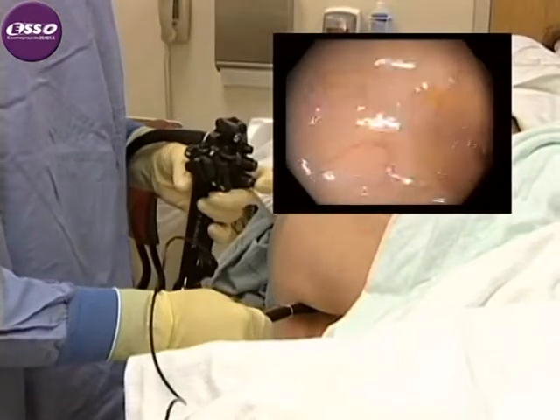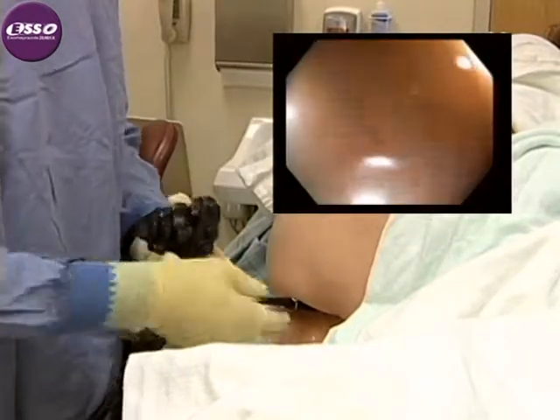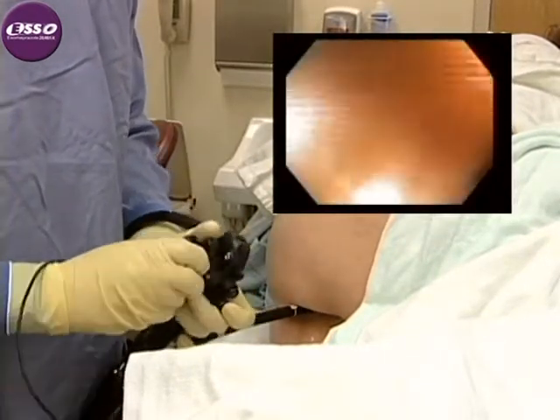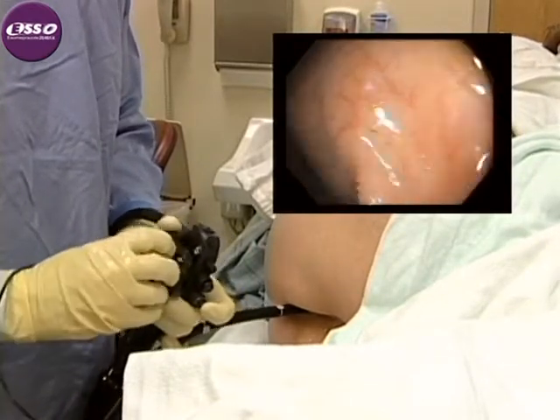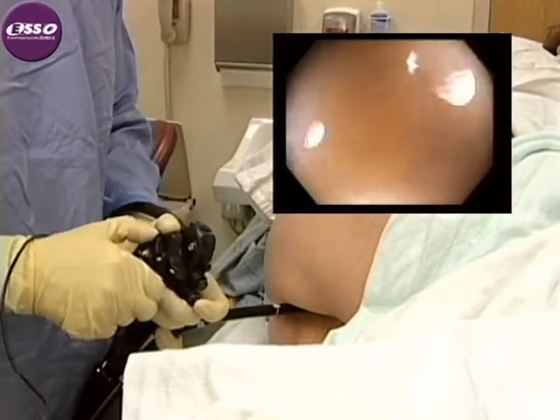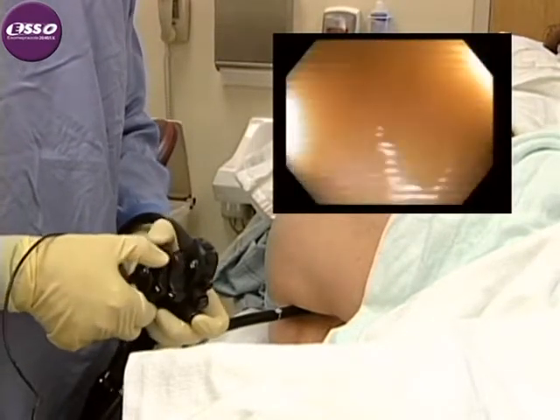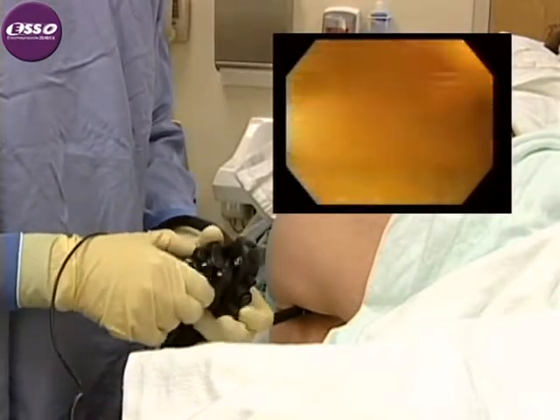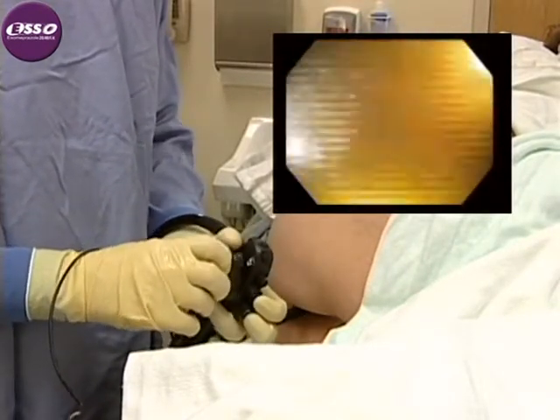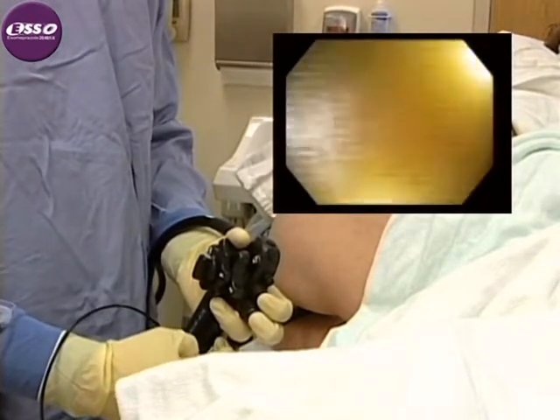Here is an example of a very difficult turn in the sigmoid colon that requires precise deflection of the instrument tip. In order to achieve this, we have placed the instrument shaft between the fourth and fifth fingers of the left hand. This maneuver allows us to continue to place forward force on the colonoscope using the left hand while simultaneously using the left hand to control the up-down control and getting precise tip deflection by using the right hand to control the right-left knob.